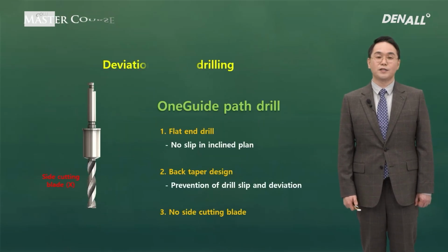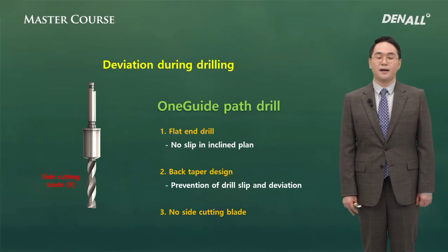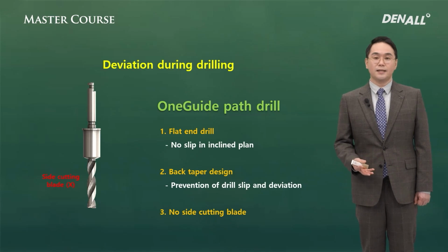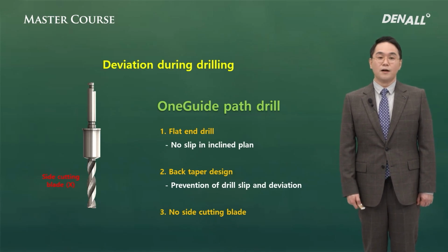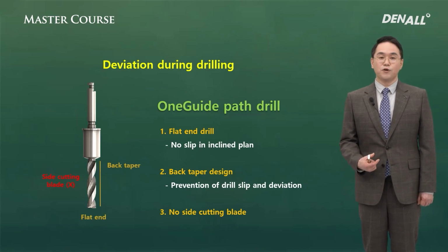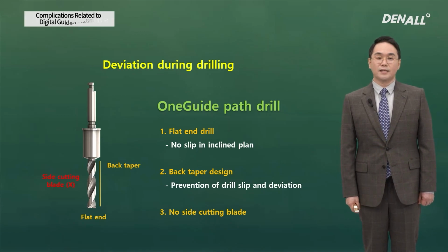In order to overcome this issue, one guide path drill has been introduced. It's not included in the one guide kit, but if you buy this accessory kit, it'll be useful. Path drill looks like this. This is not a taper drill, this is a reverse taper drill.